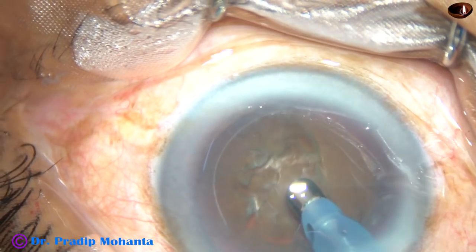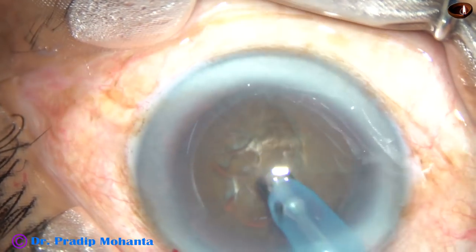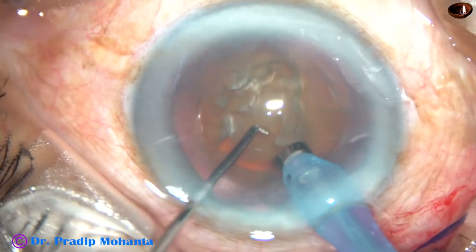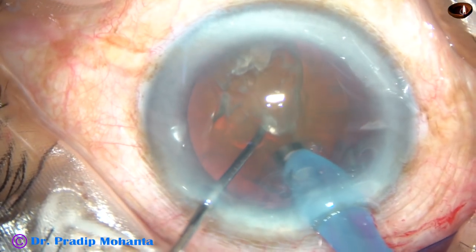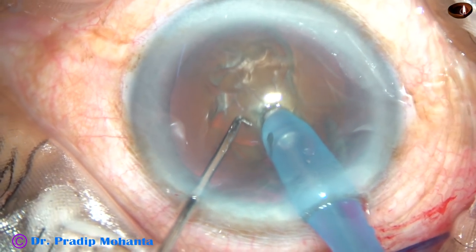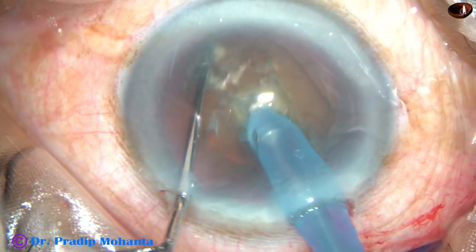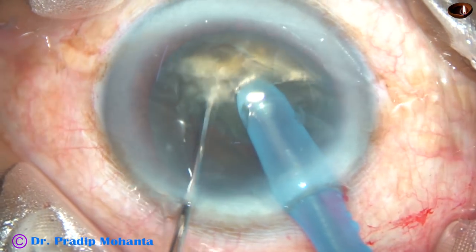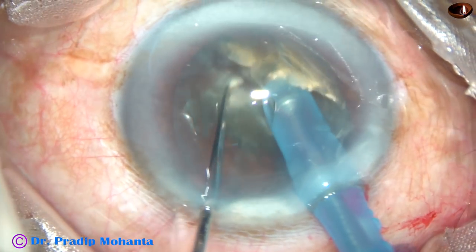And let us see how we can conquer this nucleus. The technique I am showing is submarine chop. The phaco tip moves through the substance of the nucleus like a submarine. The tip is buried into the substance of the nucleus and goes through with full energy — about 85% ultrasonic energy — and the nucleus is chopped in this way.